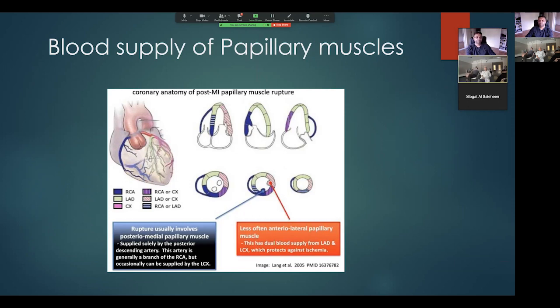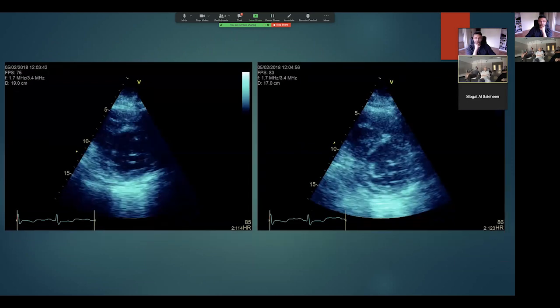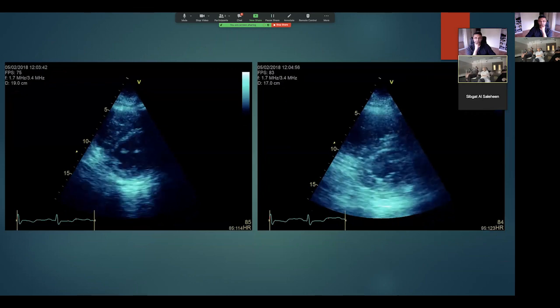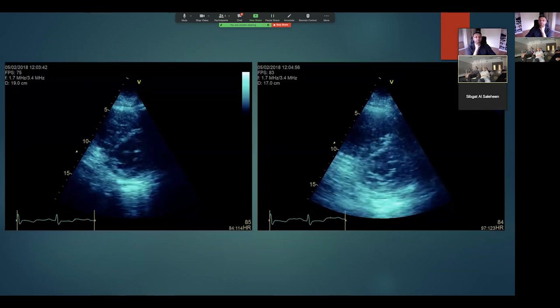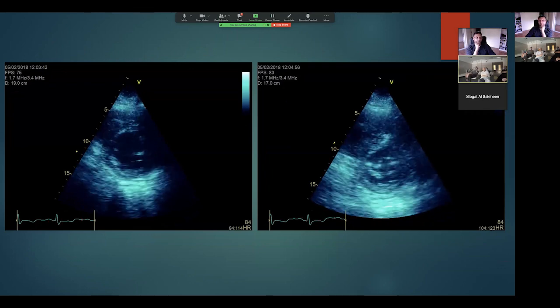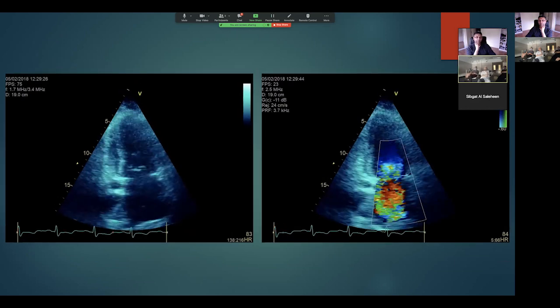Okay. Did you think on those original short axis views you could see that papillary muscle? Could we go back to those short axis views? Absolutely. You see it flicking around. The first ones, I thought that posterior muscle didn't look completely on that side there. I'll show you the pictures, you can actually see the anterolateral one is intact and the posteromedial is missing. There just seems to be some weird motion. So the anterolateral's in place and it's the posteromedial at 9 to 10 o'clock as well.